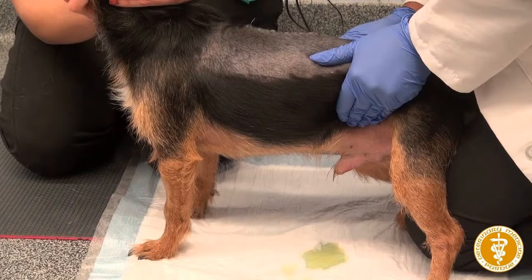When animals cannot efficiently empty their bladder, a manual bladder compression is indicated. Manual bladder compression is done for those with a dysfunctional bladder control who cannot empty their bladders efficiently. Sometimes you can see this as urine dribbling, or they are repeatedly straining to pee because they feel that they have to but cannot empty their bladders efficiently. This happens in patients with IVDD or intervertebral disc disease, those with spinal trauma, or those who underwent spinal surgery. For patients who can support their weight, they are placed in a standing position and an absorbent pad is placed below, and the lower abdomen is gently pressed with two hands.